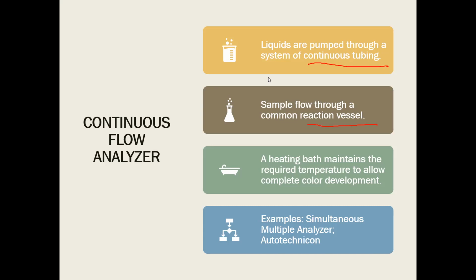Heating bath maintains the required temperature to allow the complete color development. Usually, our continuous flow analyzer is based on the color or the degree of color being tested. So, ibig sabihin, as the color intensifies, no, it is correlated to the concentration of the analyte to be tested. So, what are the examples of our continuous flow analyzer? We have your simultaneous multi-analyzer, and we also have your auto-technicon.